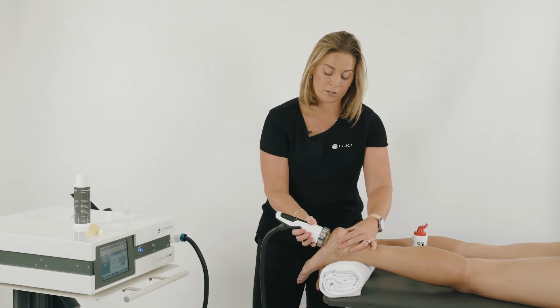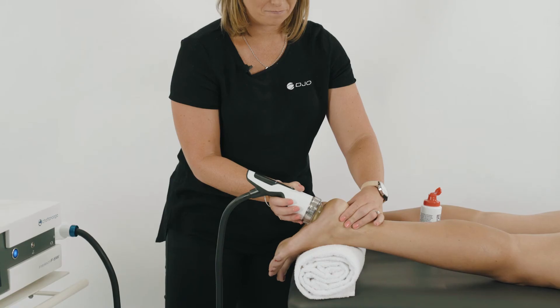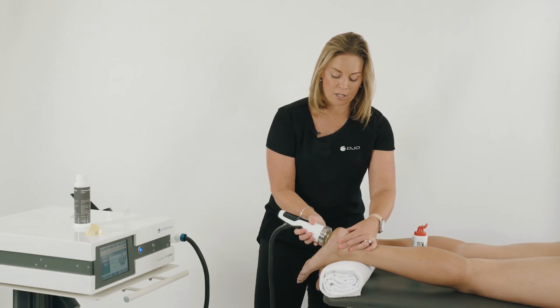This treatment is different to radial in that it's a static treatment. You might move the probe slightly to find the area of most tenderness. Once you've found that area, hover over it, gently pivoting to move the energy through the tissue.